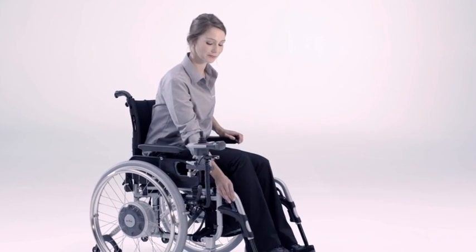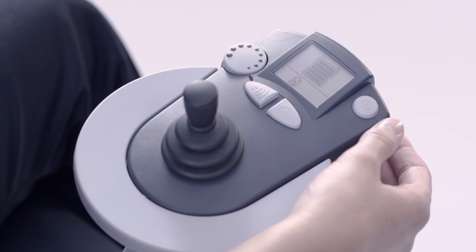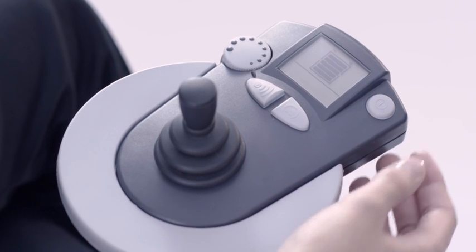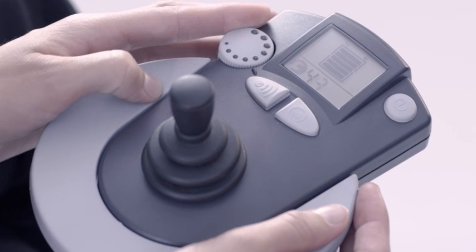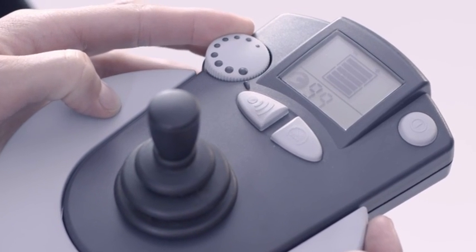eFix incorporates a very reliable battery status display. You can travel up to 16km with one charging of the battery. The maximum top speed can be set as required at the twist of a button.